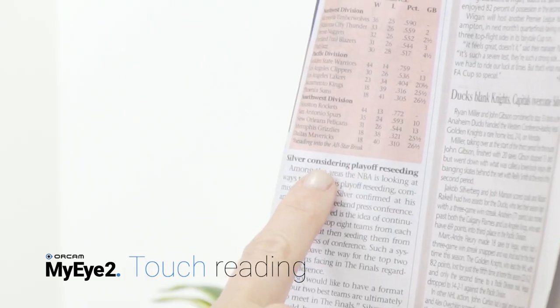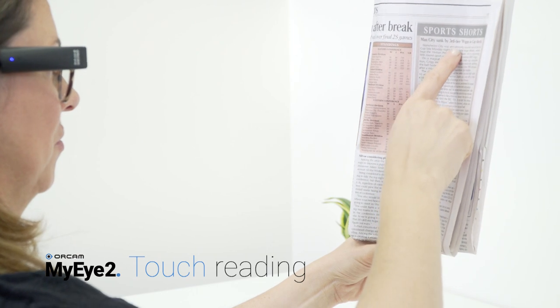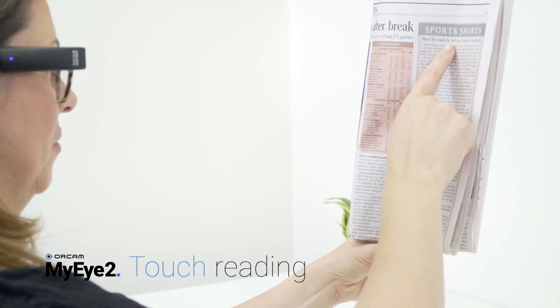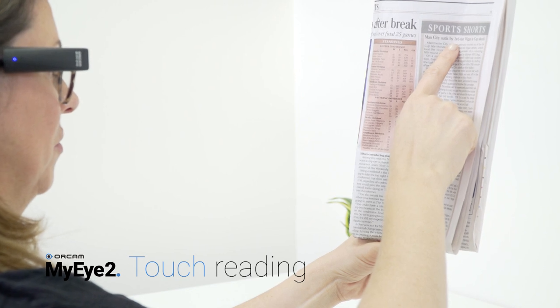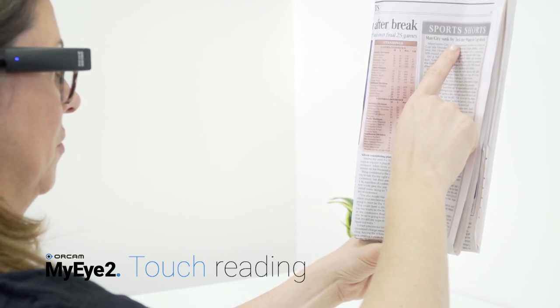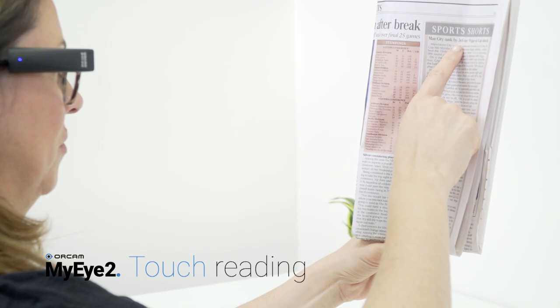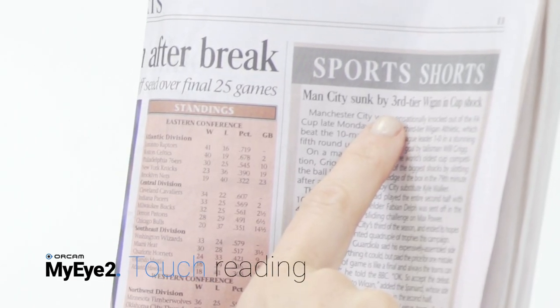Silver considering playoff reseeding. To read a new section, slide your finger to a new spot on the page. Do not lift your finger from the page. The camera will follow your finger to the next section you want to read. Man City sunk by third tier Wigan in cup shock.